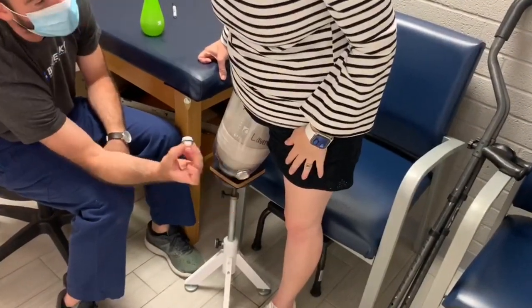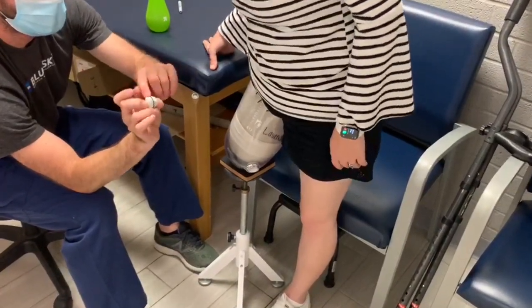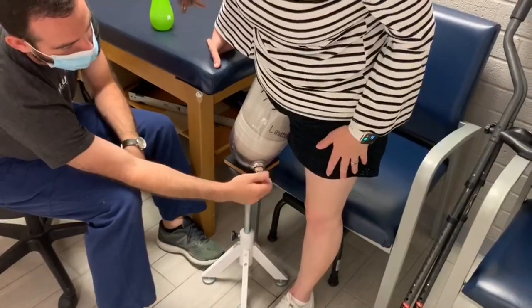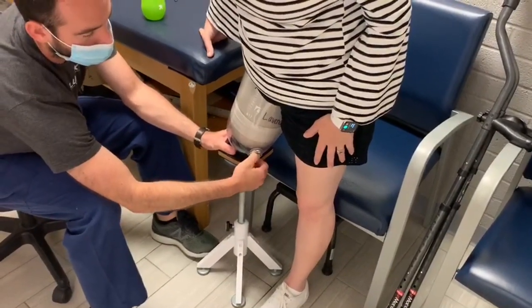So this is your one-way valve. See your little air hole in there? There's a little hole there, and then you've got one there. It goes in and then out. You just set that in there. It's just a plastic thread, so you don't have to over tighten it. Just get it to a stopping point and that's it.